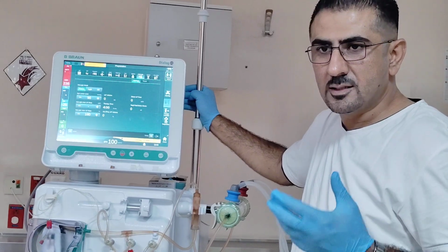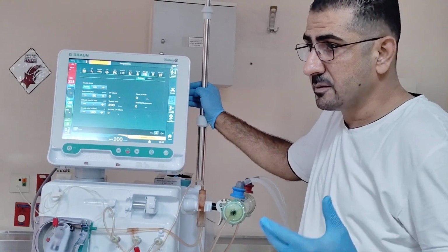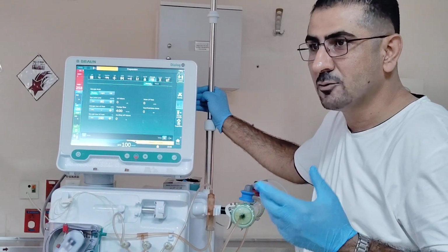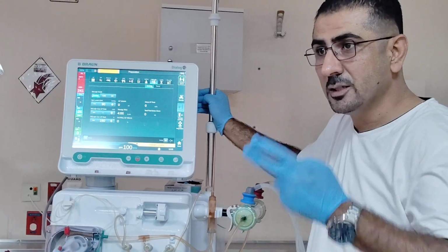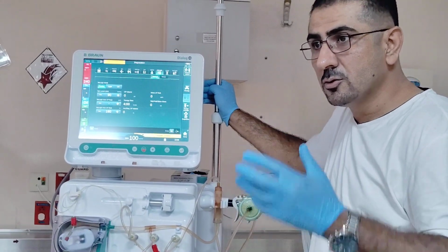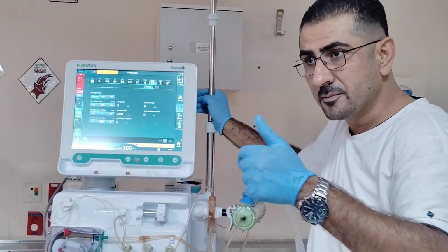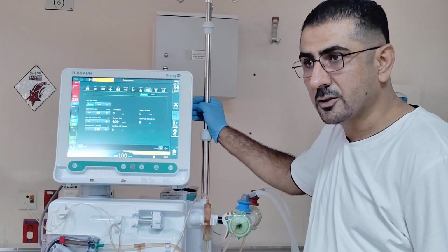As you know, when the system tries to remove more fluid from the patient, the blood will become very concentrated, and it will be an indicator of hypotension. So the system can manage this situation with two parameters: the blood pressure and the hematocrit, the relative blood volume. Okay?